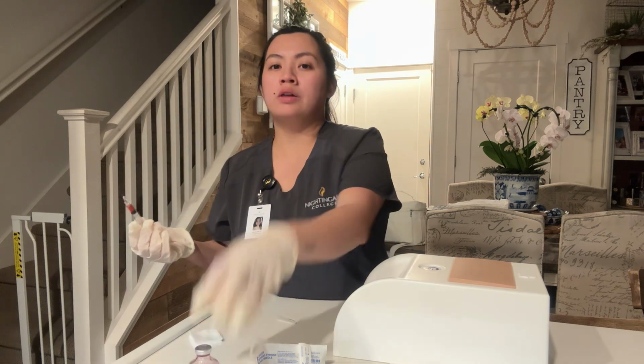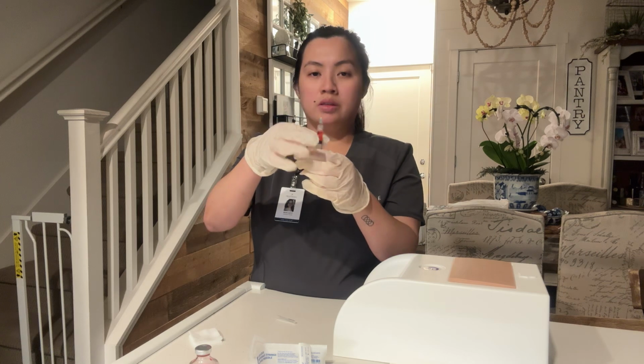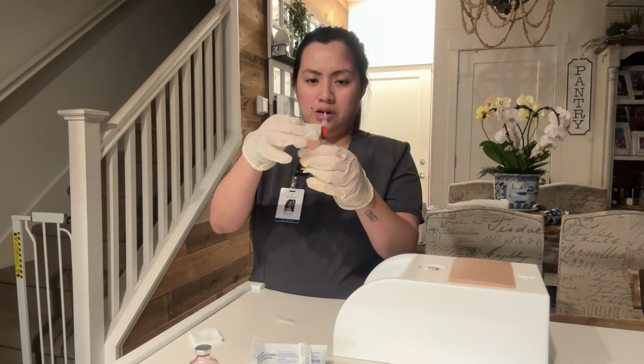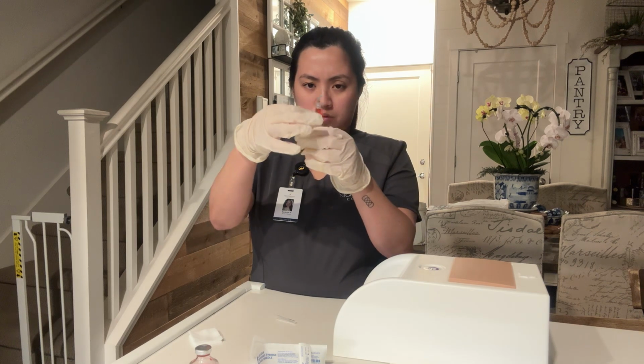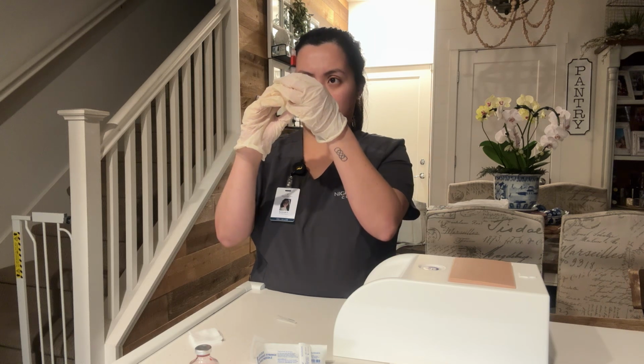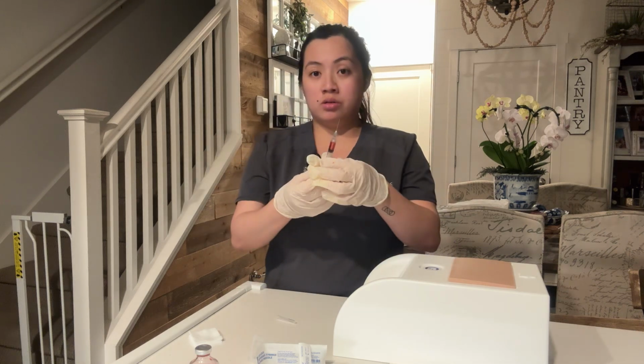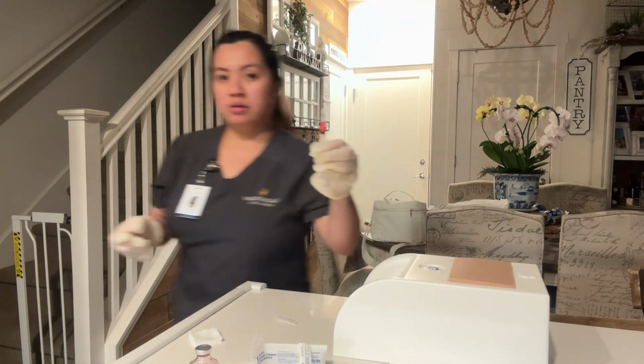Okay, and then tap the syringe to remove air bubbles and expel excess air. Okay, so now we're going to verify the dose again, which is 1 ml.